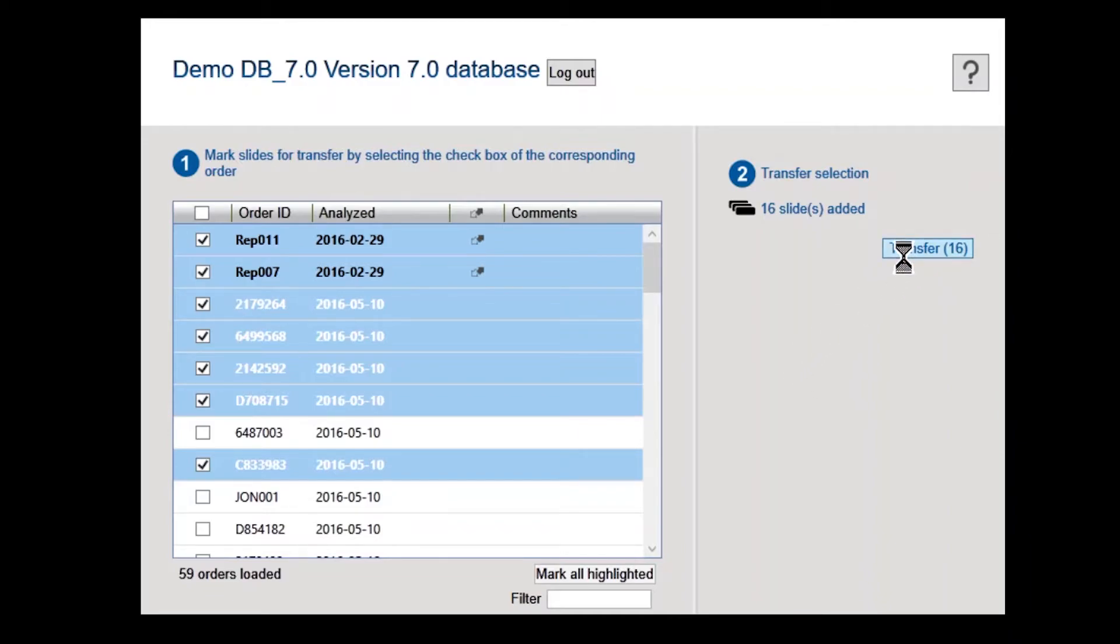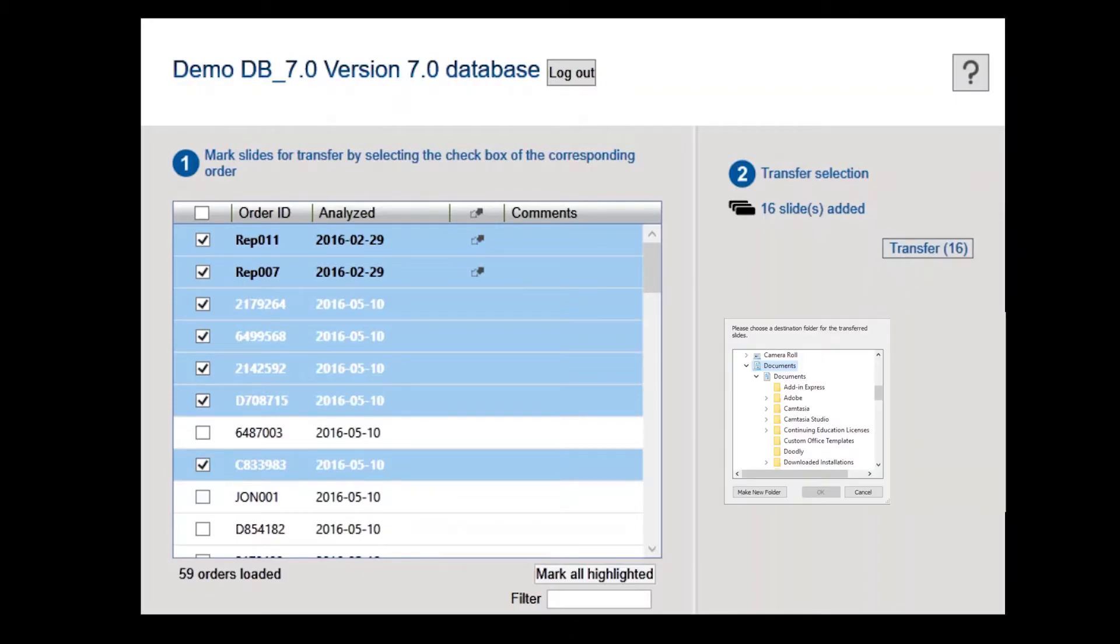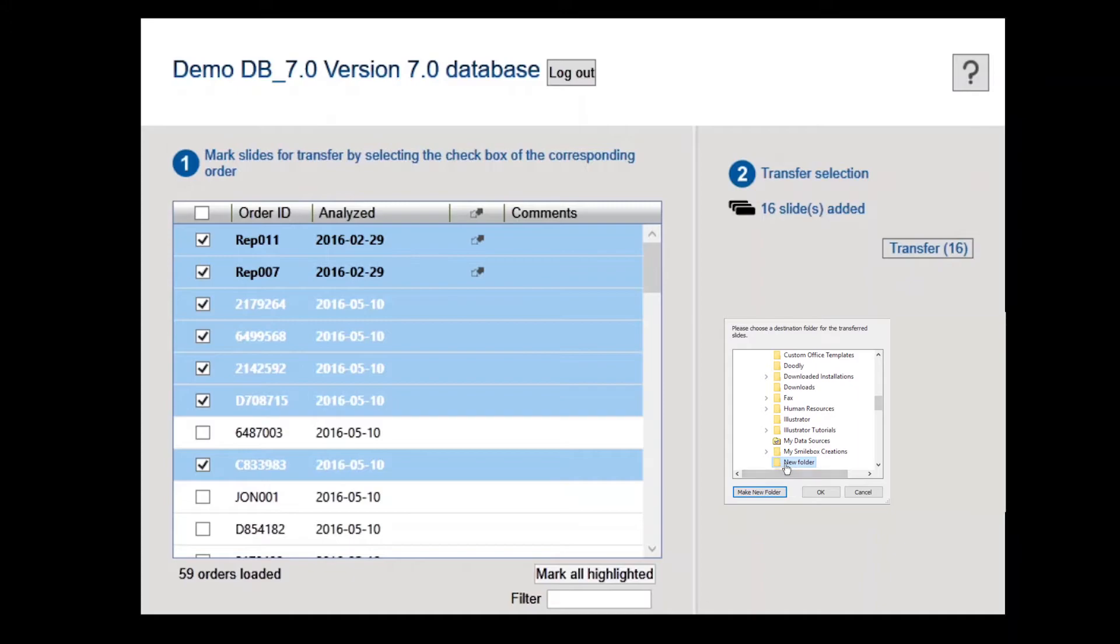Click Transfer and select a location on the hard drive and save the files. If the remote review station doesn't have access to the internet, insert a USB flash drive into the computer and select the USB flash drive when prompted for a location.